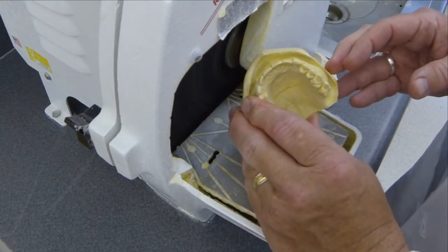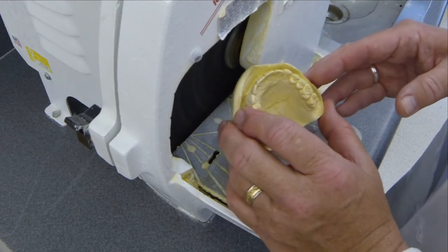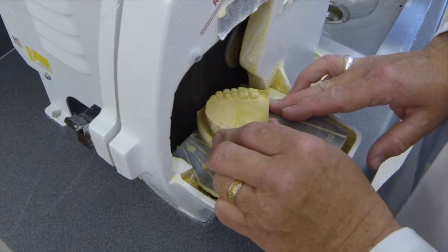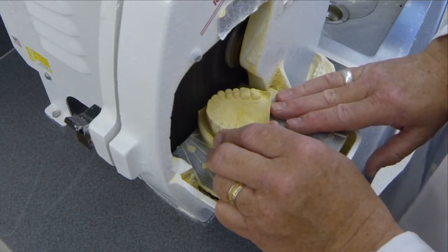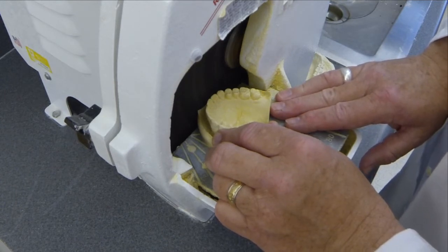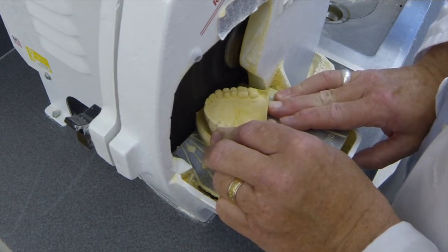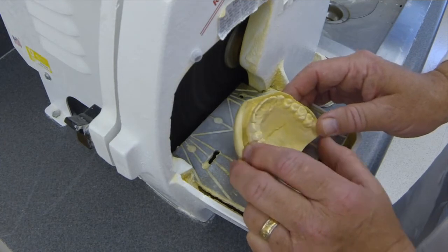Again, trying to preserve enough of the vestibule so that we will get the 1 millimeter depth and the land area. As you're doing this cut, always watch the incisal edges of the anterior teeth so that you're not trimming them. You do not want the teeth to be caught in the trimmer. So my general rule is to not go any closer than 2 to 3 millimeters.